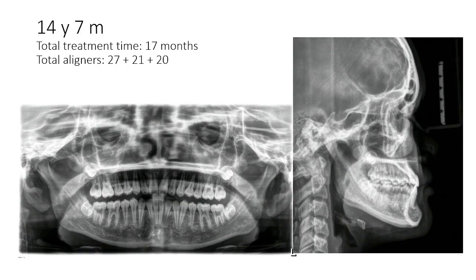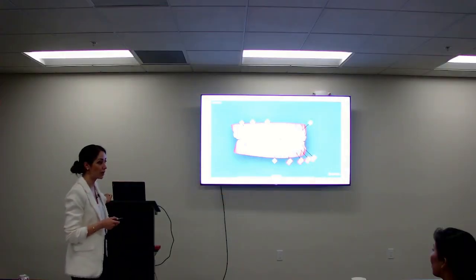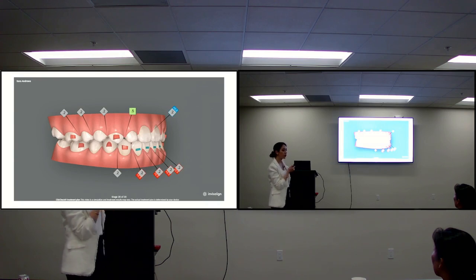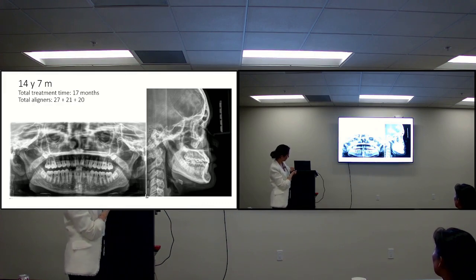And then you look at this panel, and what's wrong with that panel? Look at my lower lateral incisors. Did you catch the roots? They're mesially tipped. Why? Because I had power ridges, because Invisalign told me to put power ridges to tip the roots lingually, but I did not put enough distal root tip in my laterals. Huge. Every one of my cases now gets attachments on mandibular laterals, without exception, because I want distal root tip. Especially when you're leveling the curve of Spee, when you're intruding lower incisors, you need that. So yeah, that's a beautiful finish, but hey, I could have made those laterals better.